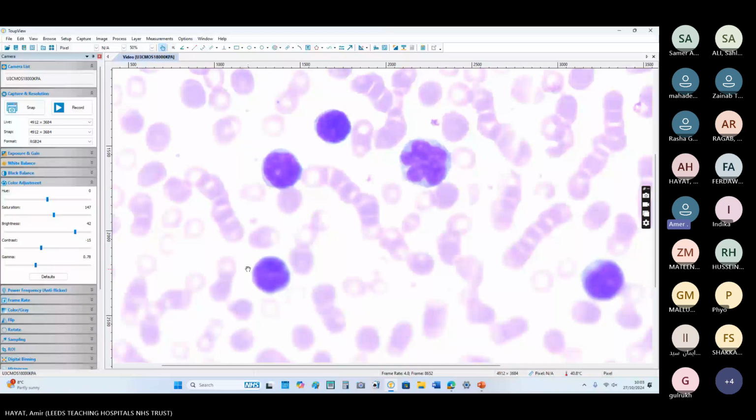Only one or few of them are having flower-like type of cells. Patient is completely normal. A patient with ATLL would have constipation or polyuria, or some sort of symptom presenting. But this patient is completely normal. So you never make a diagnosis on morphology. Always say likely or possibly. Then you are saved in the exam.